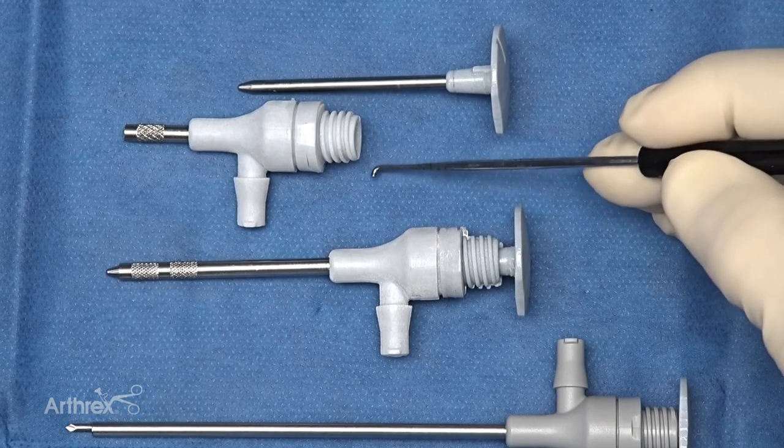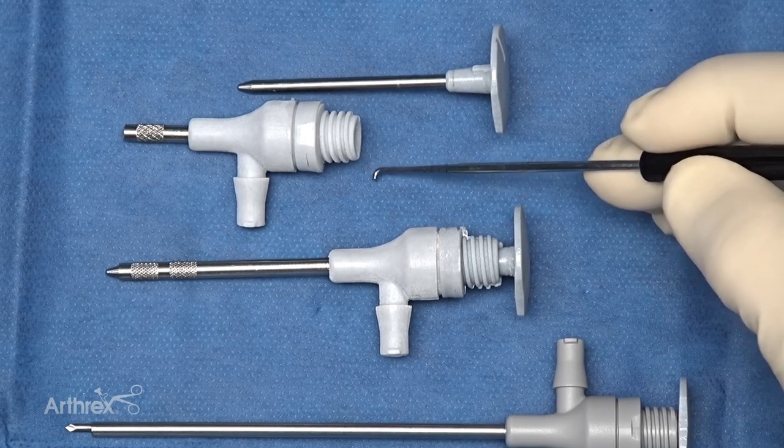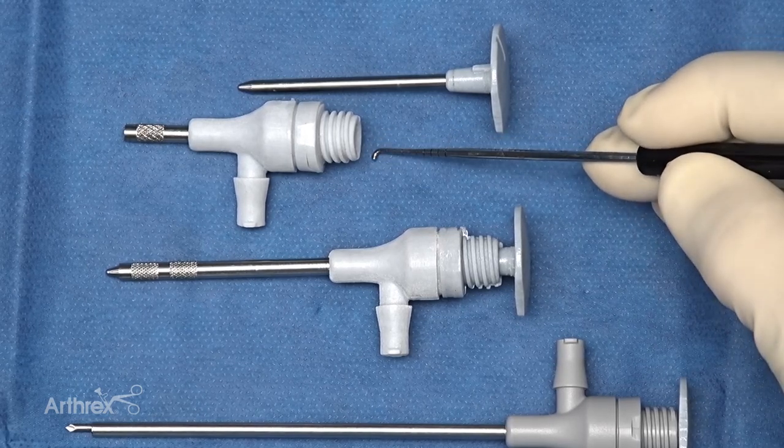Another advantage is that it's interchangeable with our entire nano system. It can easily work with our new Sabre shaver, which can go directly in here as a working portal, and it can also be used with our new nano small joint instruments.